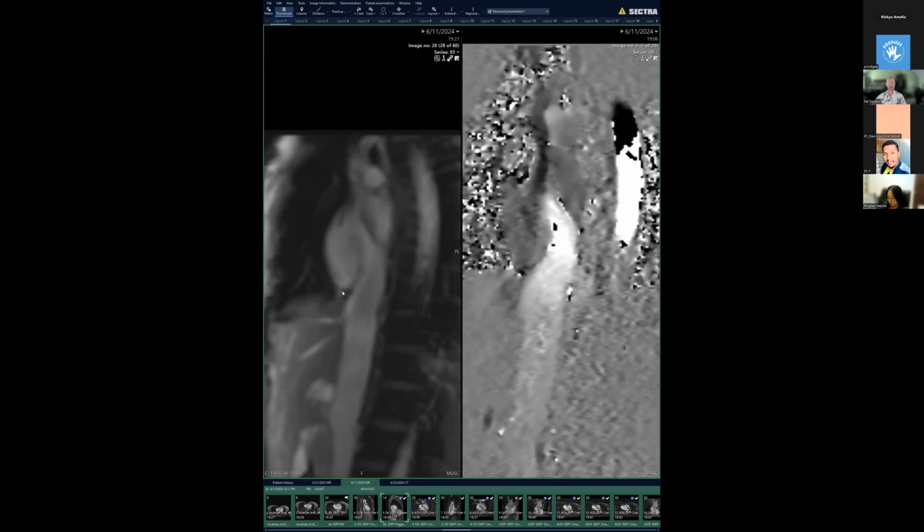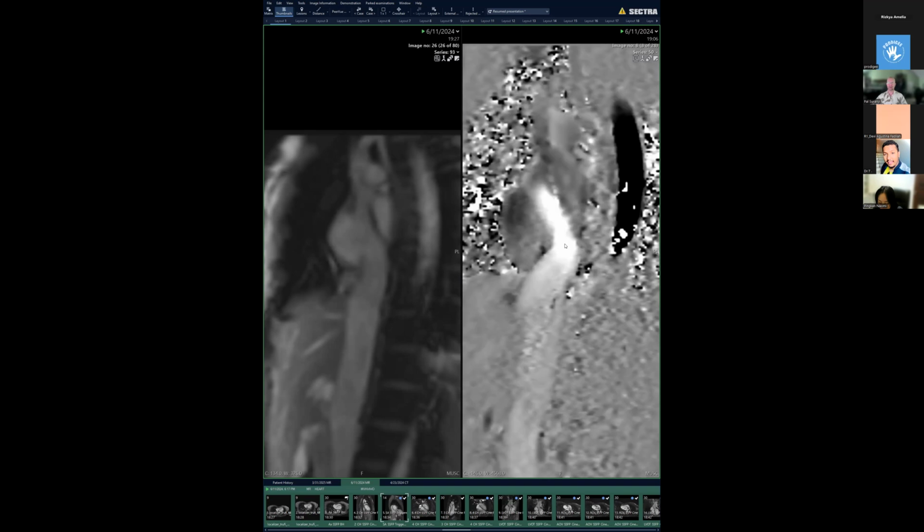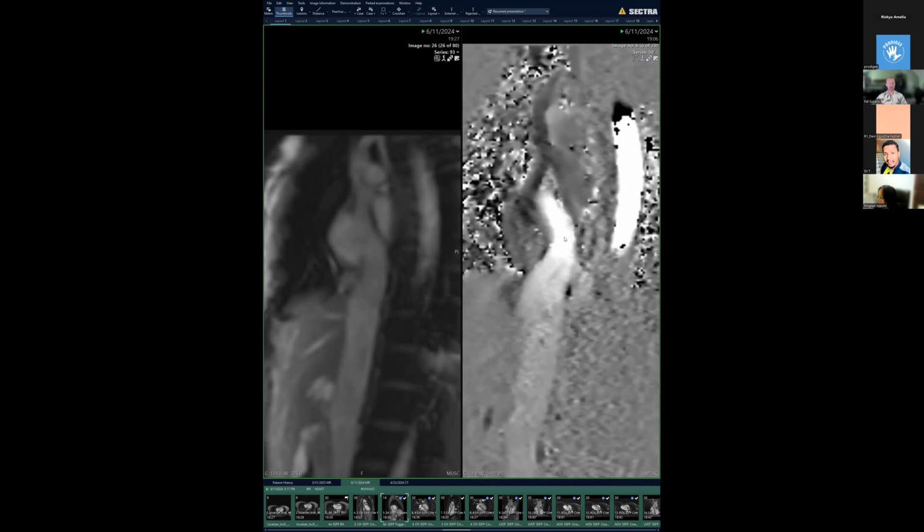So it is possible that during exercise, as this patient often exercises, the anterior-posterior compression is pronounced, and with the way she's exerting herself, it is possible that there is some narrowing here at the IVC inflow that gives her basically the symptoms of hepatic congestion and abdominal pain and all that. But like I said, there's no pericardial problem.